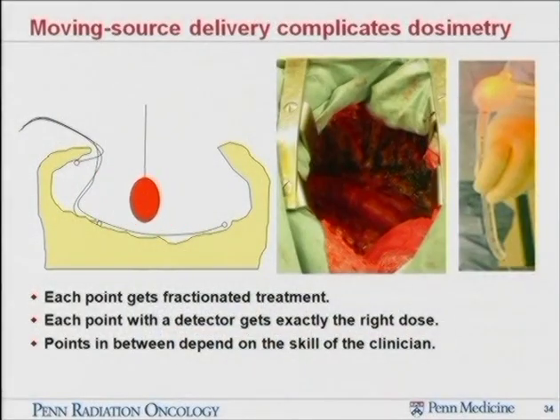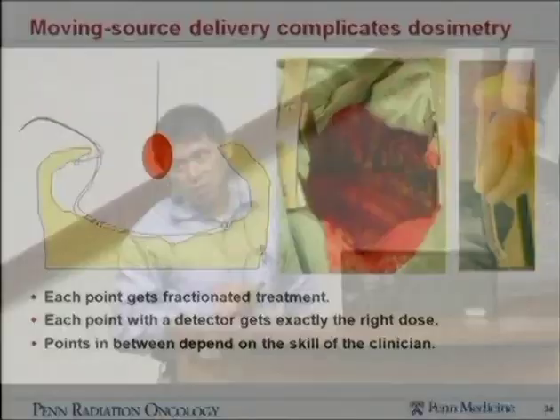And it's a very long treatment, typically an hour up to 2 hours, depending on the cavity size, because it's different from patient to patient. So we have been doing this light dosimetry for a long time. Then the next question is, of course, how do you guarantee the light is delivered homogeneously all the way around the entire pleural surface?